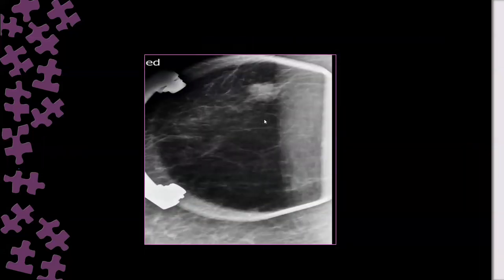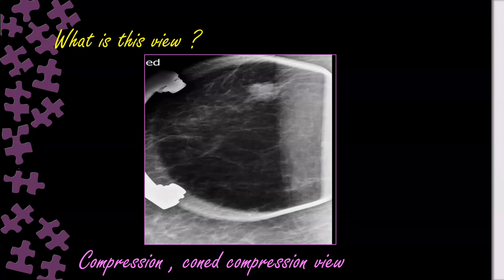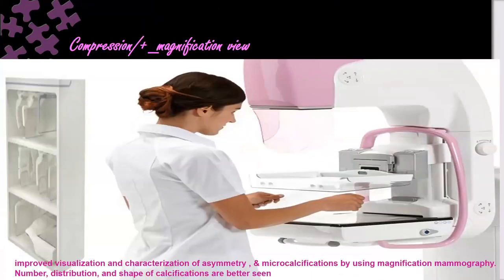So what is the cone compression view? We said this is the compression or cone view. What are the other names for that view? Can you see here?